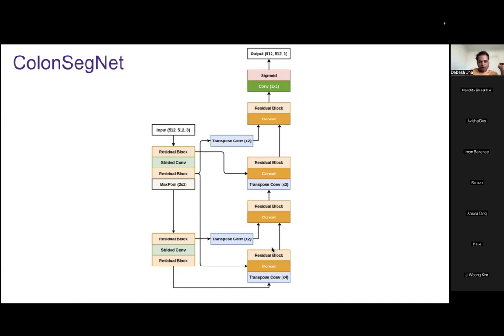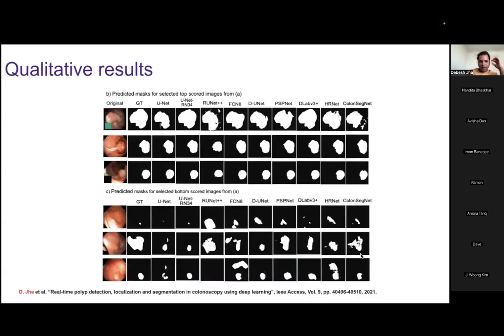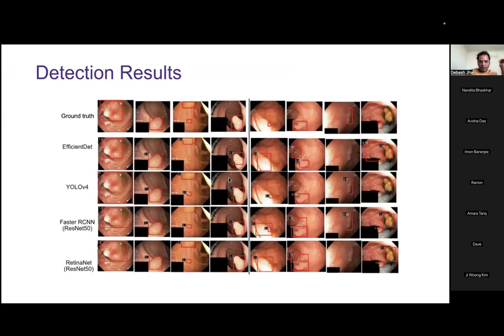So it has two encoder and two decoder blocks. Instead of using upsampling or bilinear upsampling as in ResUNet++, here we use transpose convolution because we also want the model to learn, since the model is already lightweight. So we use transpose convolution of factor 4, and then the same thing goes here. The process follows and then you get the output. In terms of results, this architecture was not the best, as you can see here, but the processing speed was really high. At the same time, the qualitative and quantitative results were also promising.